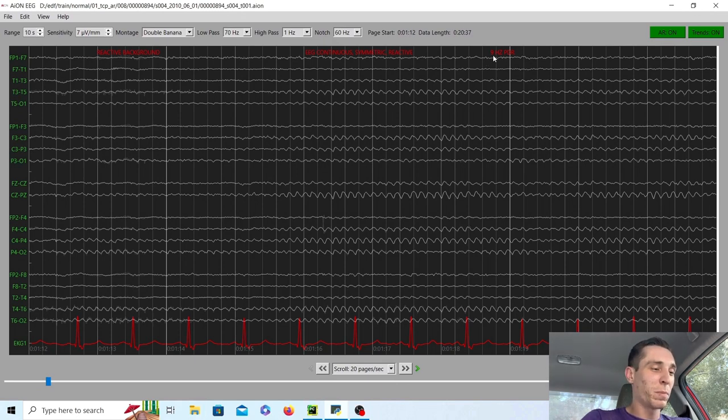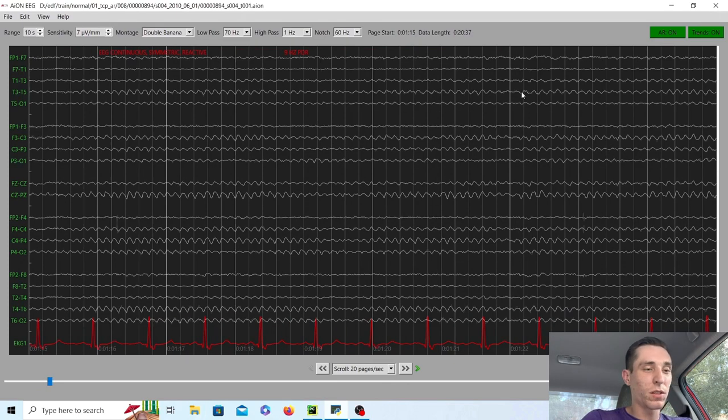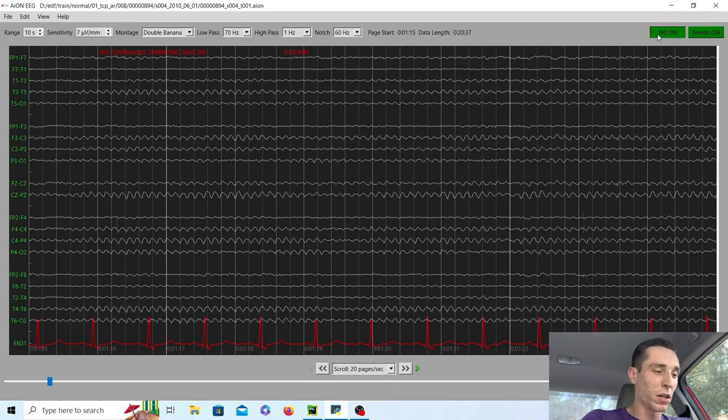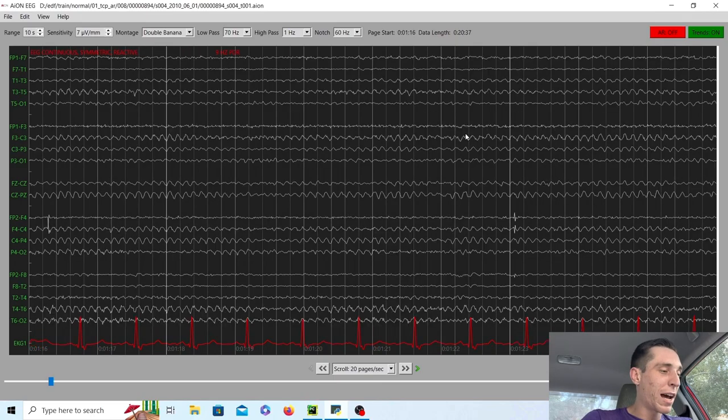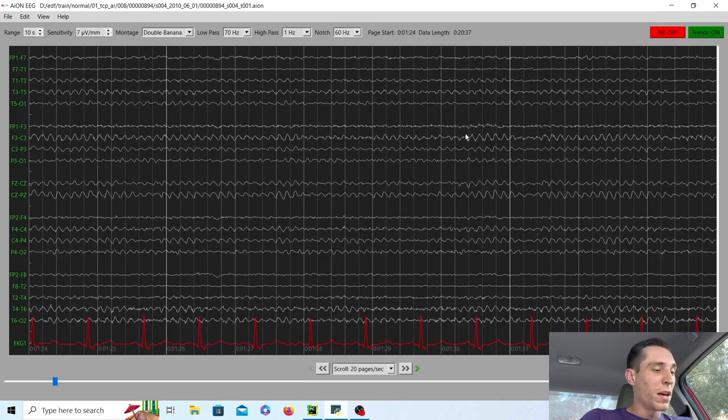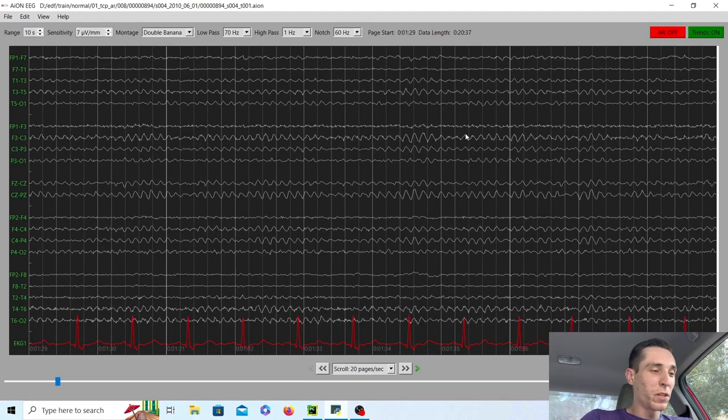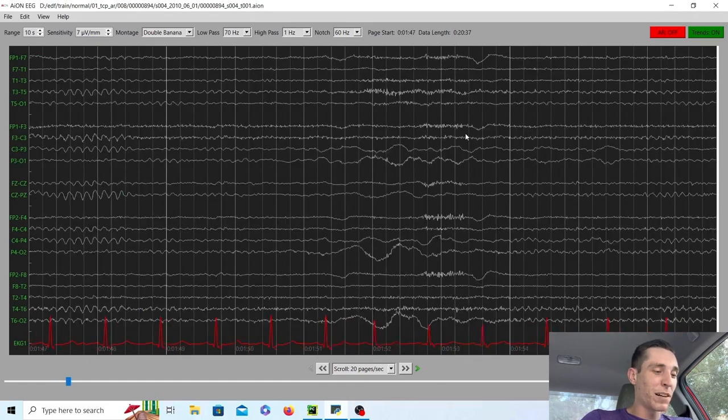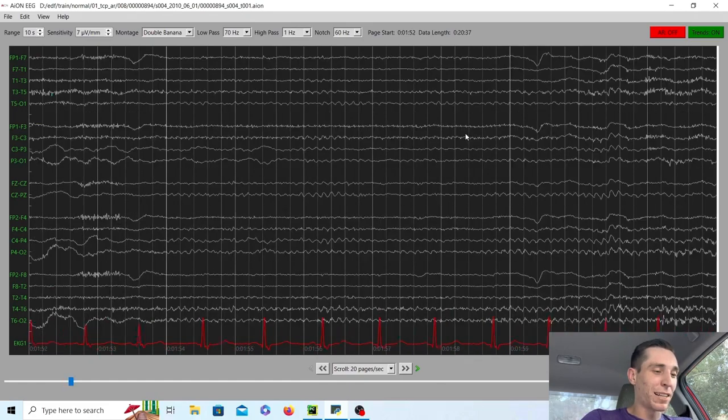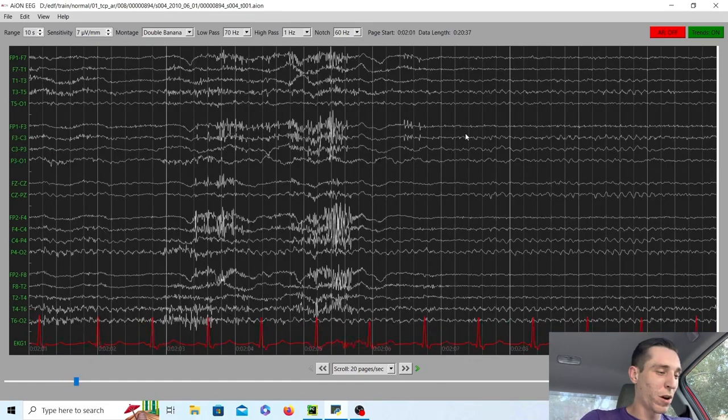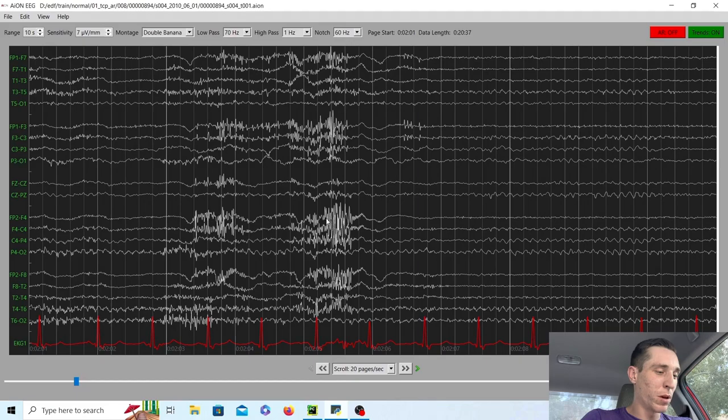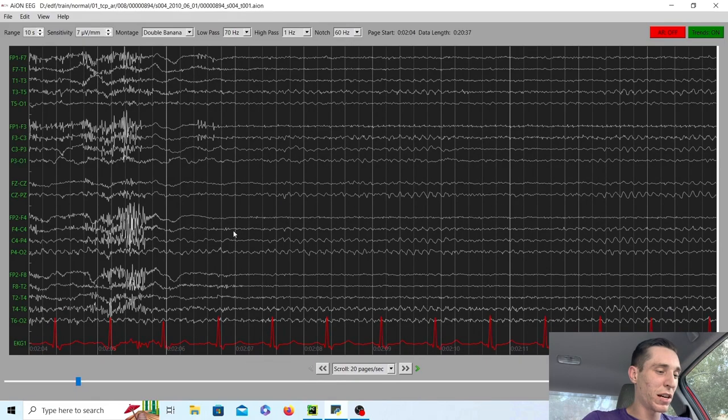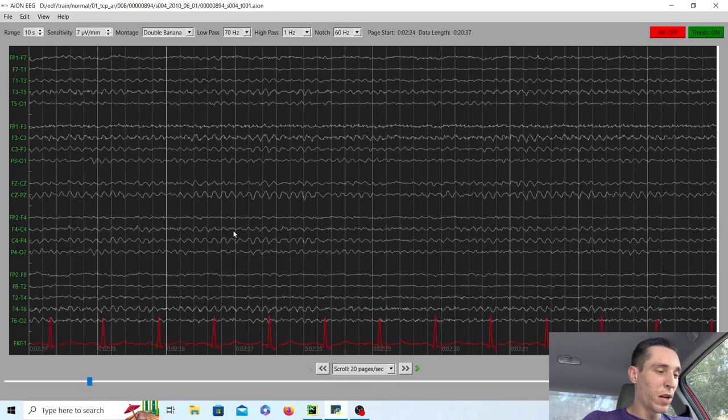And in this patient, we're going to get about nine waves per second. So this is while they are awake. So everything's looking good. We tested the reactivity of the background. Very normal EEG and I'm very satisfied with this record so far. Here's a little bit of muscle contamination there and we scroll on.